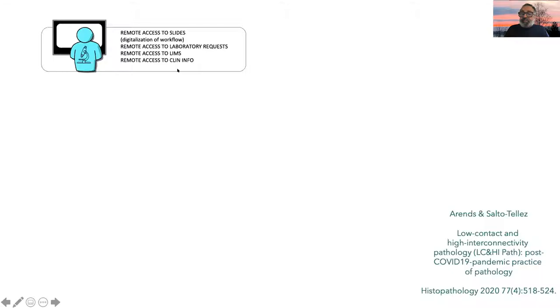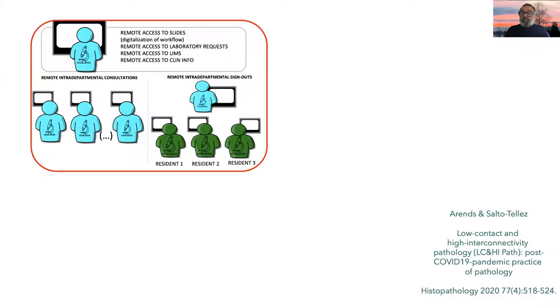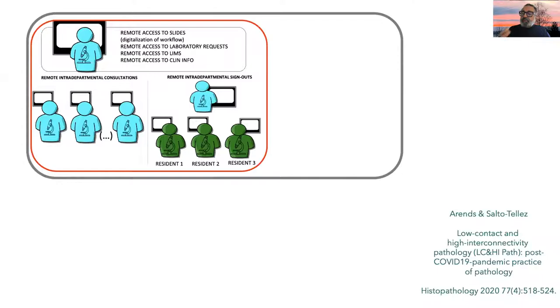It needs access within the same department to be able to have consultations with other pathologists, the equivalent of taking a slide to the office next door to show to your colleague. And it should be able as well to do the sign-outs with trainees, with residents, in a remote way and in a totally in silico manner. When you move out from the department into the hospital, you should be able to start linking with your clinicians one-to-one and being able to discuss cases.